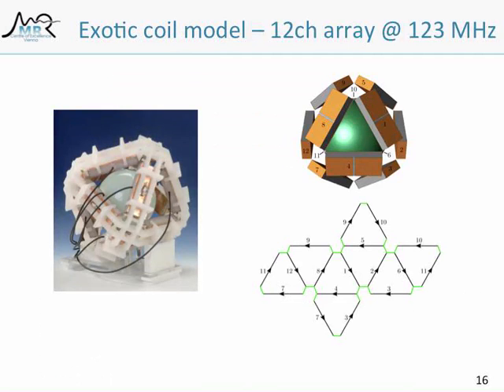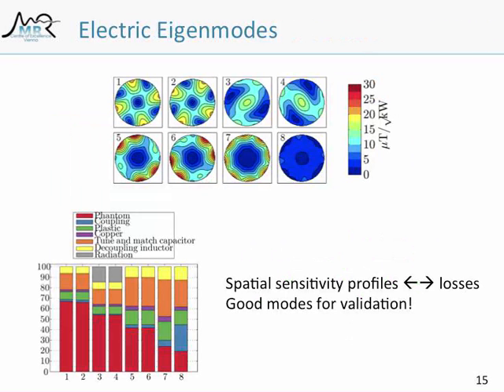So, as I was saying before, let's say, yes? This one is normalized value, right? As a 100. The previous one is just 100%, normalized. Is there any different mode has different kind of efficiency, for example, one mode where the efficiency is maybe higher than the others? What's really efficiency here is power that goes into the phantom, because everything else is lost, right? This scale is transmit efficiency scale. Yes, it's transmit efficiency.